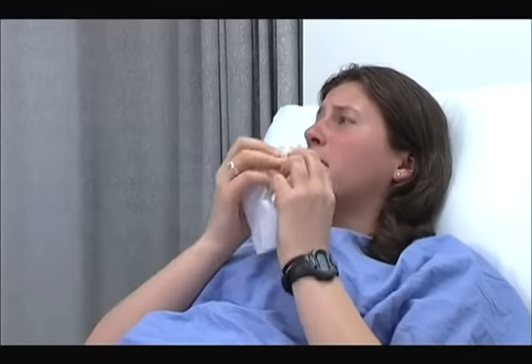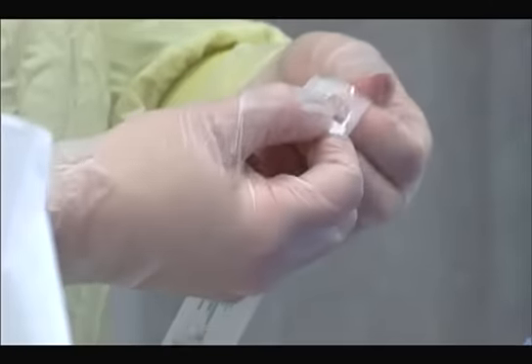Okay, Melanie, we're going to now, actually I just want to do a check with your nose. And I'm going to have you just wipe, if you can, your nose and see if you can remove all the secretions. Yeah. The patient's nasal passages should be clear of mucus prior to the insertion of the swab.